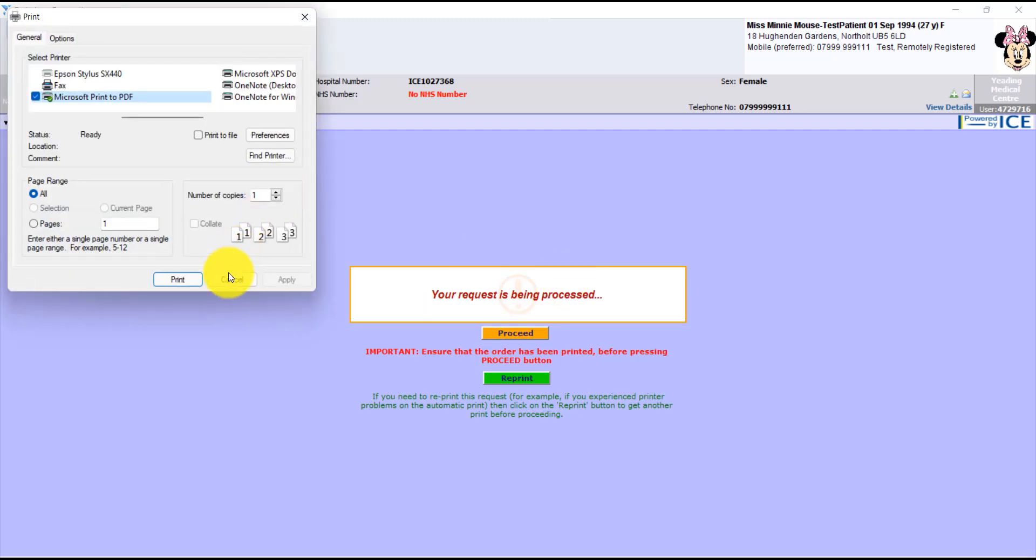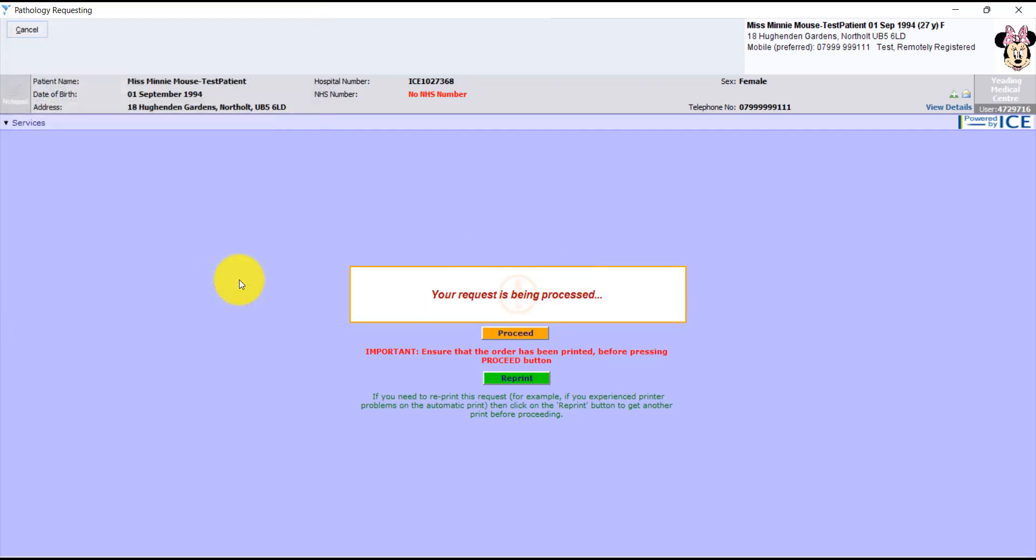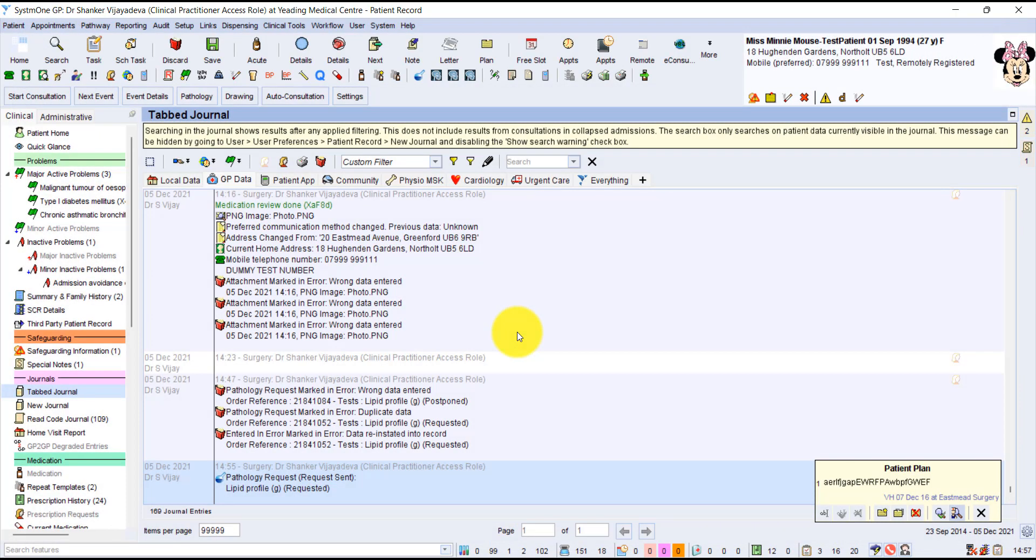And here we go. It gives us the option to print it out. Always worth remembering you have the option to print to PDF. That could be useful if you ever have to send forms or create forms to send elsewhere.